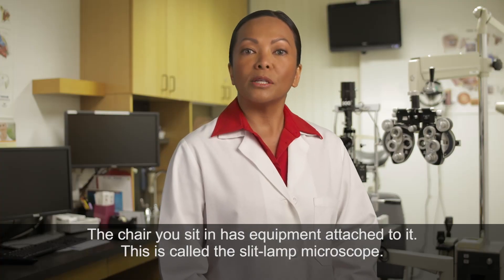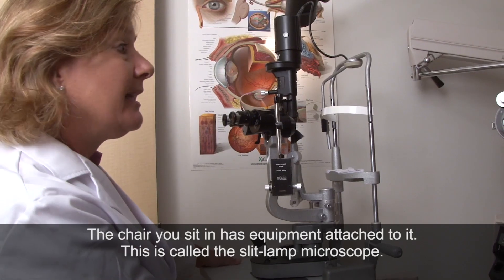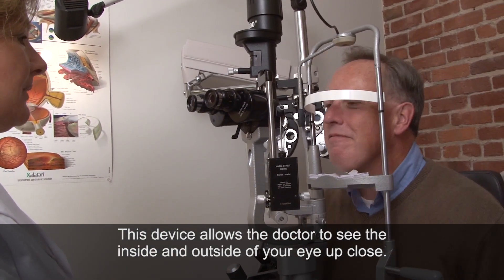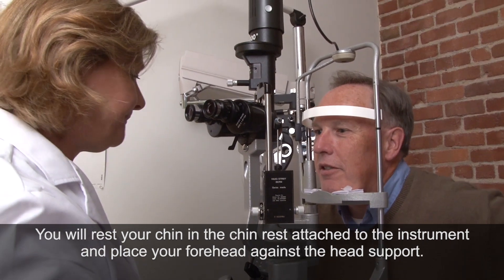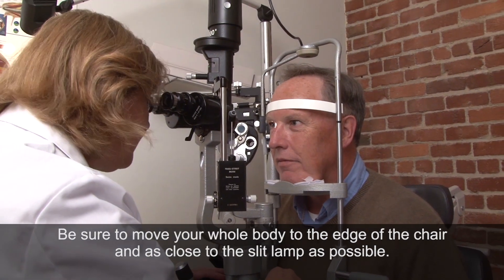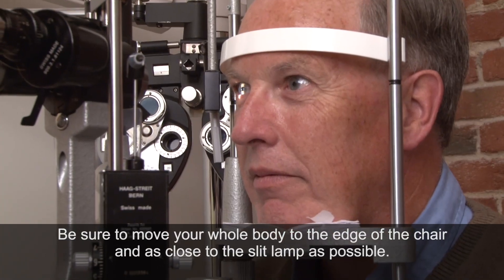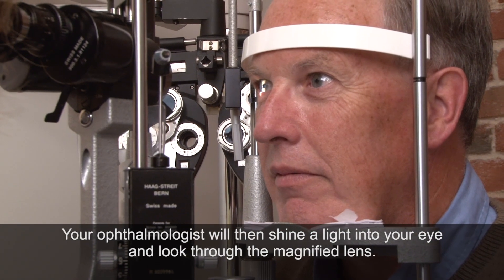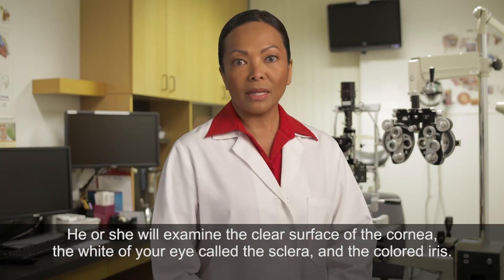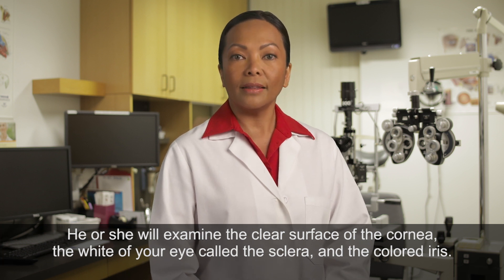The chair you sit in has equipment attached to it called the slit lamp microscope. This device allows the doctor to see the inside and outside of your eye up close. You will rest your chin in the chin rest attached to the instrument and place your forehead against the head support. Be sure to move your whole body to the edge of the chair and as close to the slit lamp as possible. Your ophthalmologist will then shine a light into your eye and look through the magnified lens, examining the clear surface of the cornea, the white of your eye called the sclera, and the colored iris.